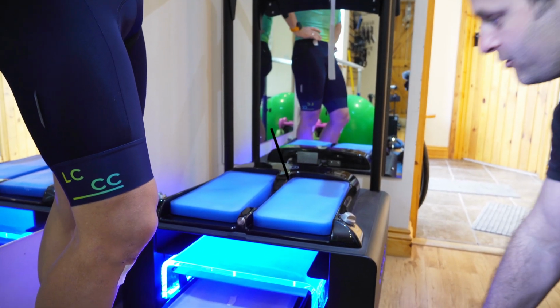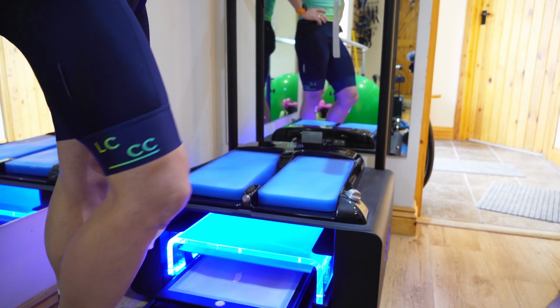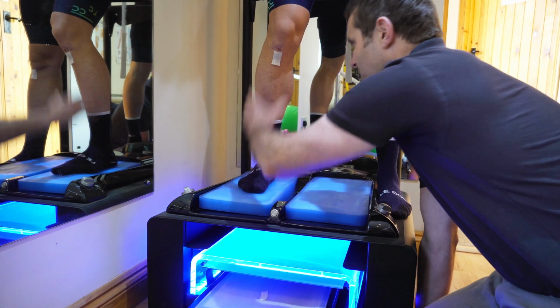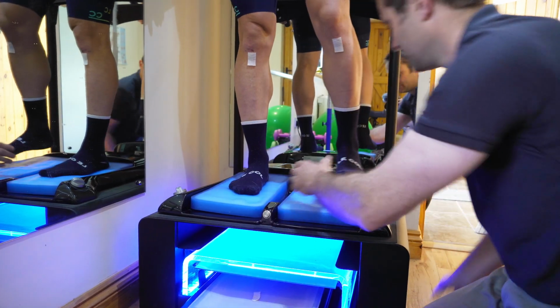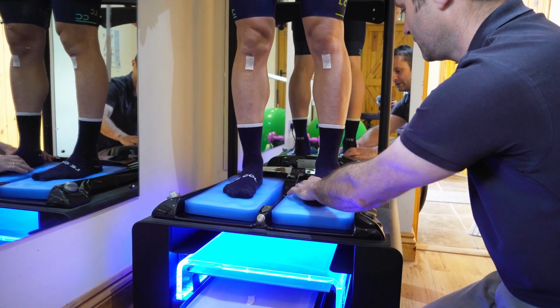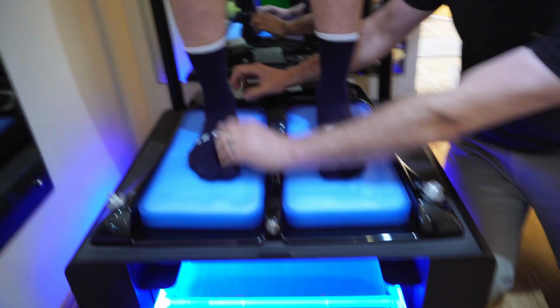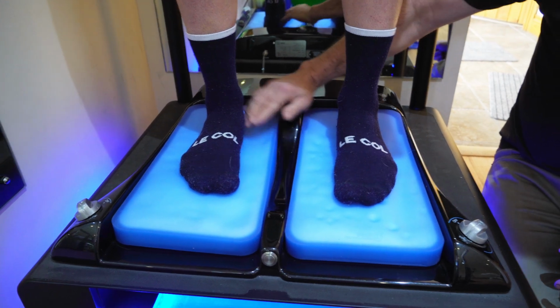Essentially it's quite a simple process, but we're going to take a moulding of the feet from Chris, slightly toned in. That's it, you can stand on that leg now. And we're going to put that foot there. Okay. You can clearly see that the forefoot is nice and strong, but the rear foot is where the instability lies.